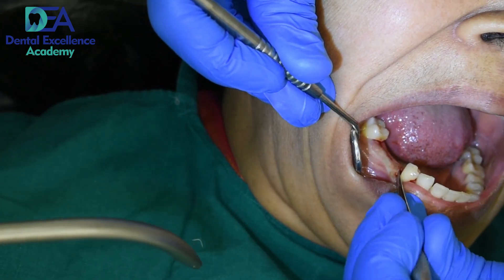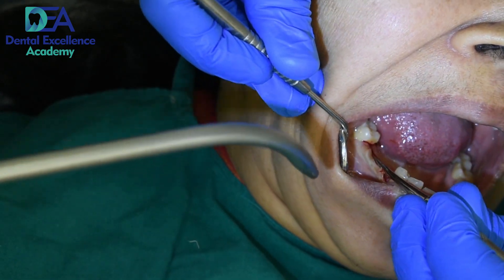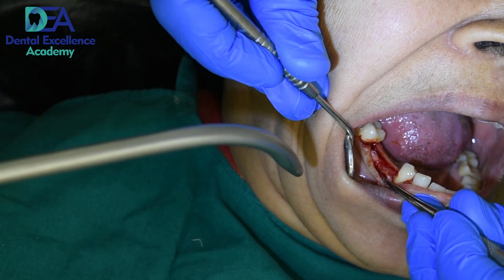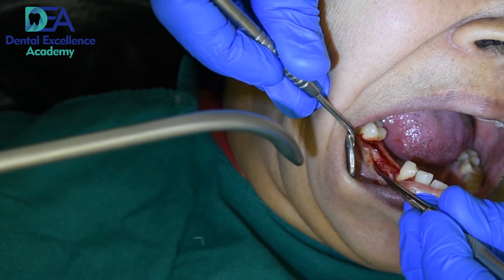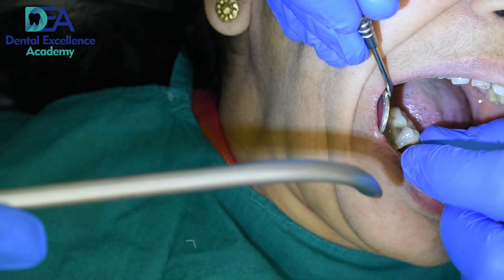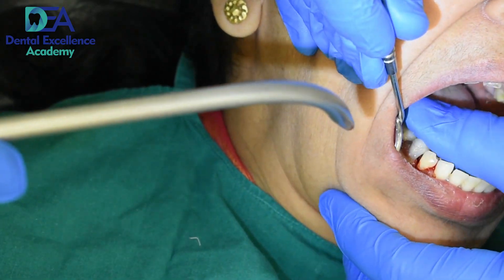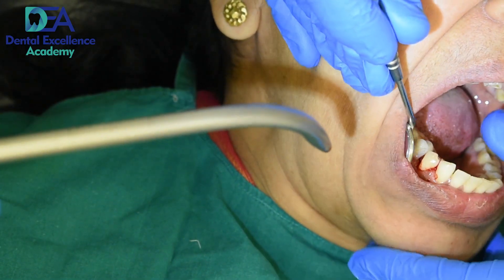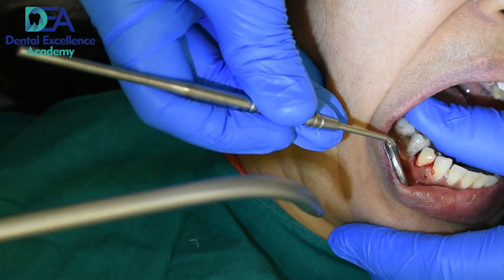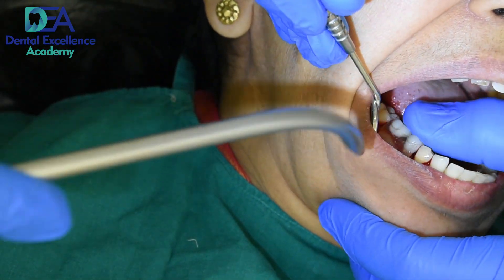In this region I don't give a vertical incision as we are close to the mental foramen, which is very close to our surgical site. We will just reflect the mucosa and again we will try the removable partial denture. It is not fitting properly now because we have reflected the gingiva.